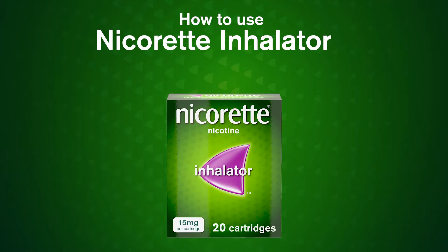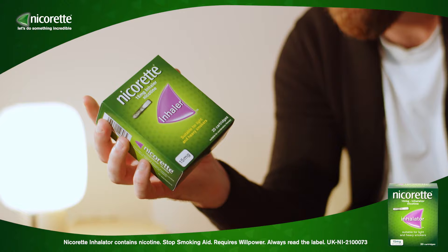Here is how to use the Nicorette Inhalator — a clinically proven nicotine replacement aid that provides the hand-to-mouth action of a real cigarette.